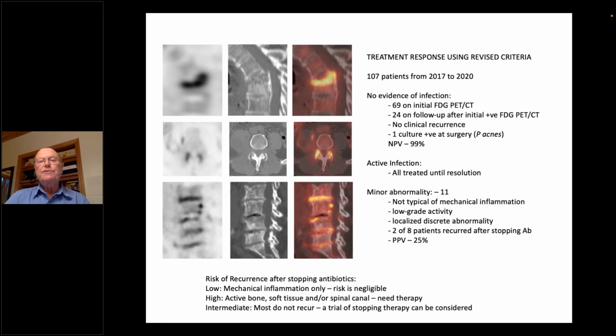And patients who had this pattern, 8 of them had abnormalities at the time that antibiotic treatment was stopped, and 2 of those 8 patients recurred. Actually, the 2 illustrated on top.